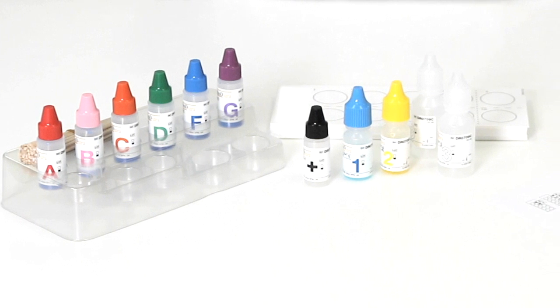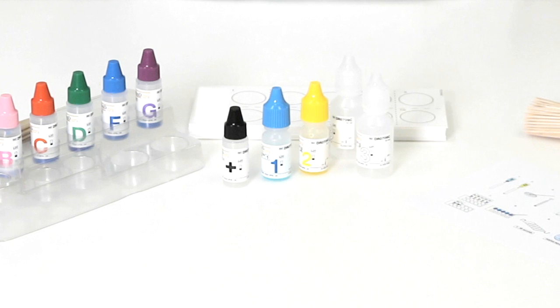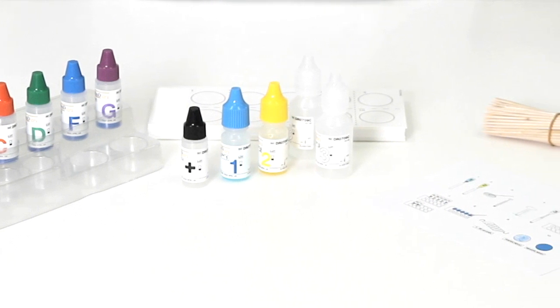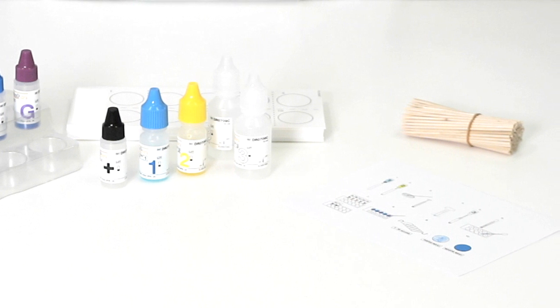With the ThermoScientific PathoD Extra Strep Grouping Kit there is no compromise. It provides identification of all significant strep groups, including group D, with acid kit speed and no need for incubation.